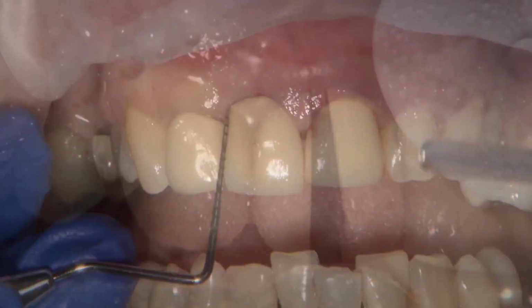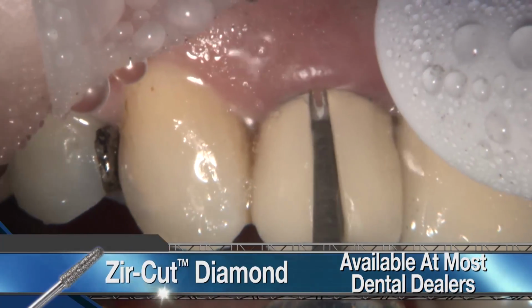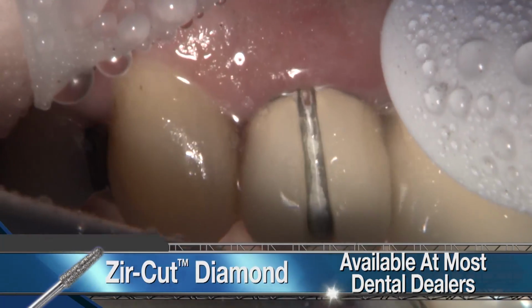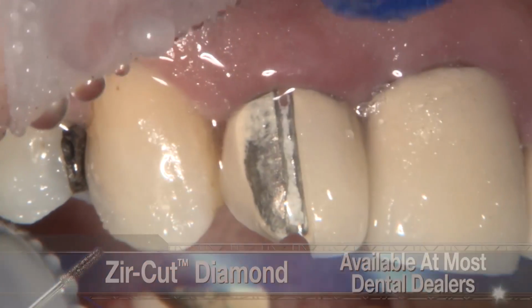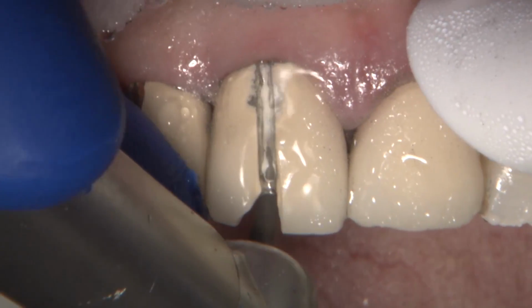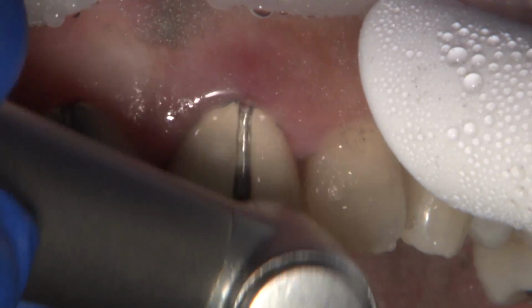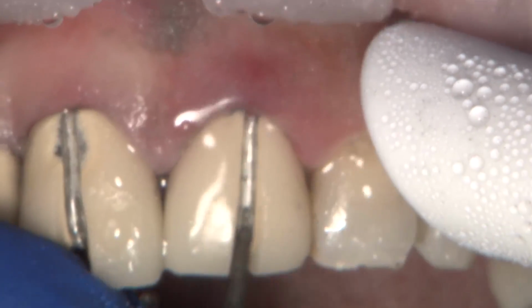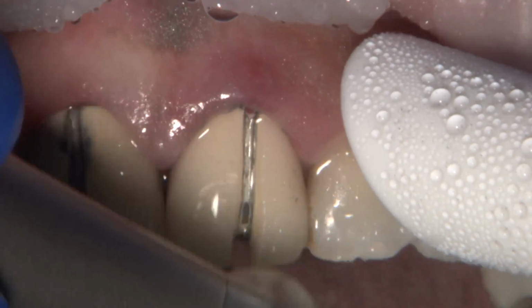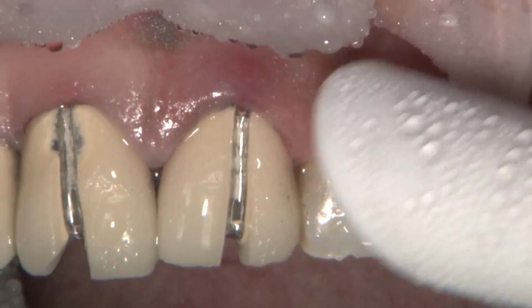I begin cutting off the crowns by making a vertical opening with a tapered zir cut burr and extend this opening across the incisal edge. I will also go over the lingual, since these crowns have a very thick lingual metal collar. I want to make sure I separate the metal all the way to the gingival margin, and great care should be taken not to nick the gingiva.